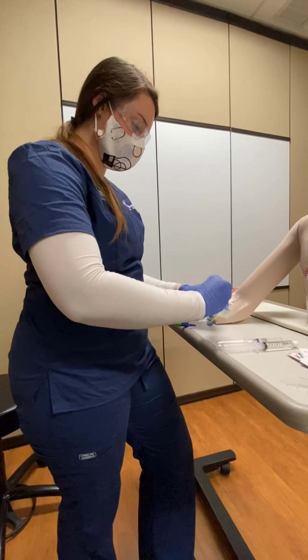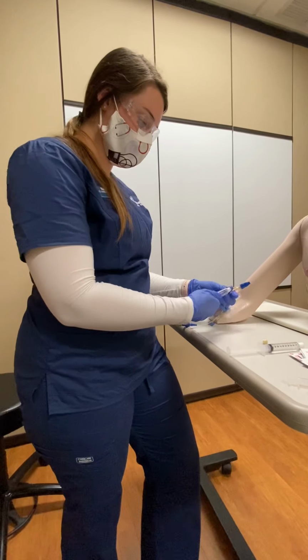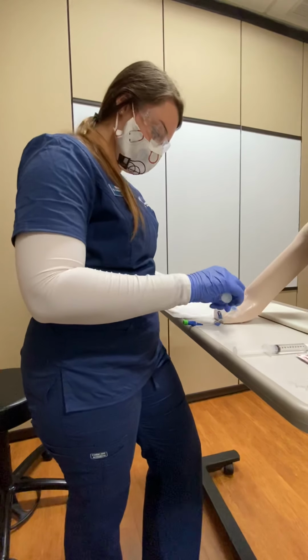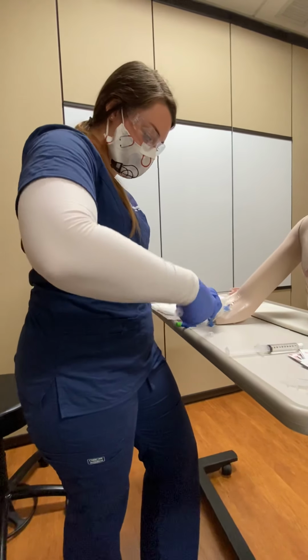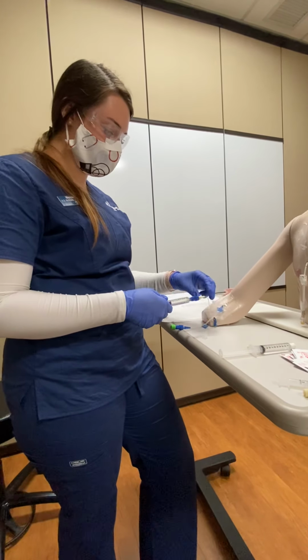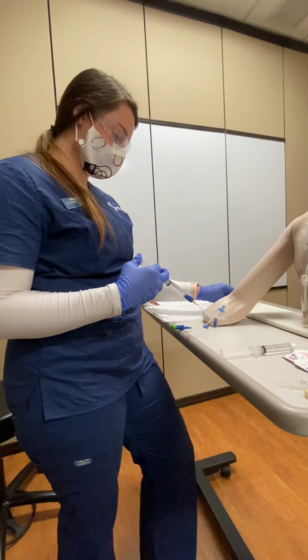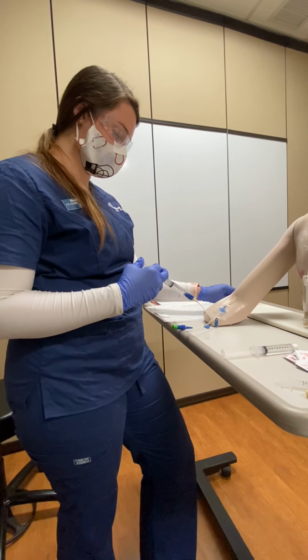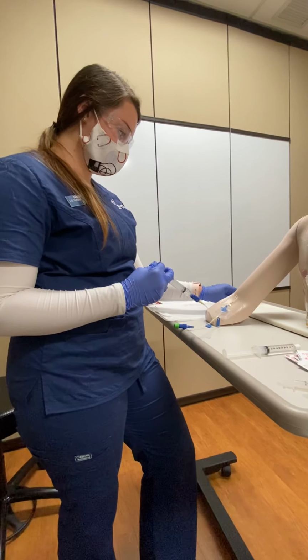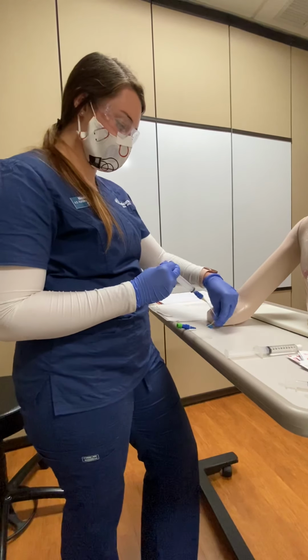All right, cleaning the port again. Getting the air out. Inserting, and I will administer this over the 2 to 5 minutes, just like the medication. But in this case, I'm just going to give it. Okay, I'm going to lock.